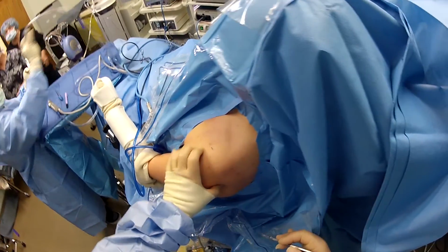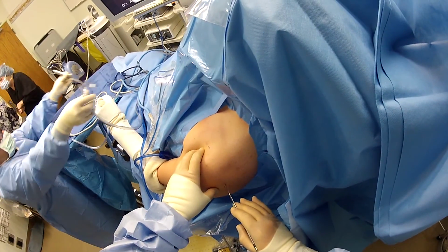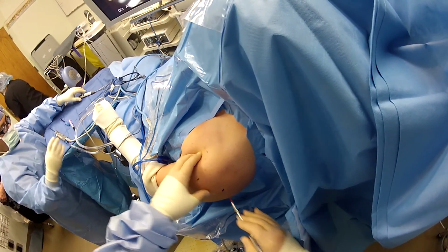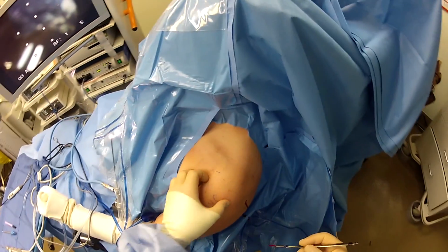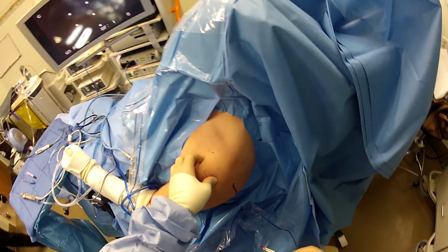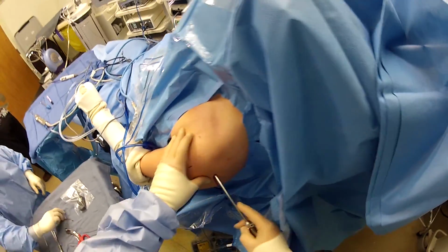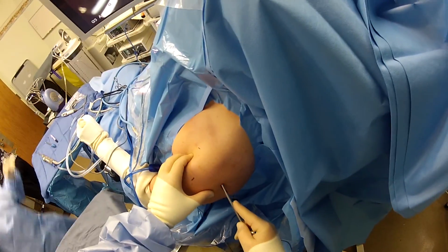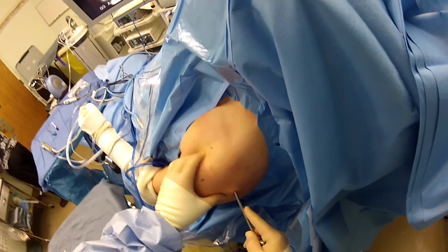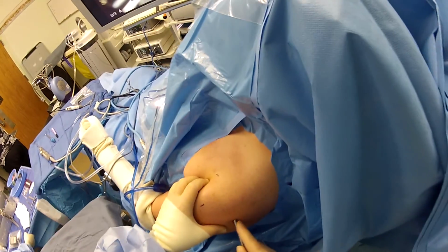This is Dr. Craig Zeman. We're going to do an arthroscopy on this gentleman. He has osteolysis of the distal end of the clavicle and has been having pain. So he's been injected, taken oral steroids and anti-inflammatory medications. We treated him for about 6 months conservatively.